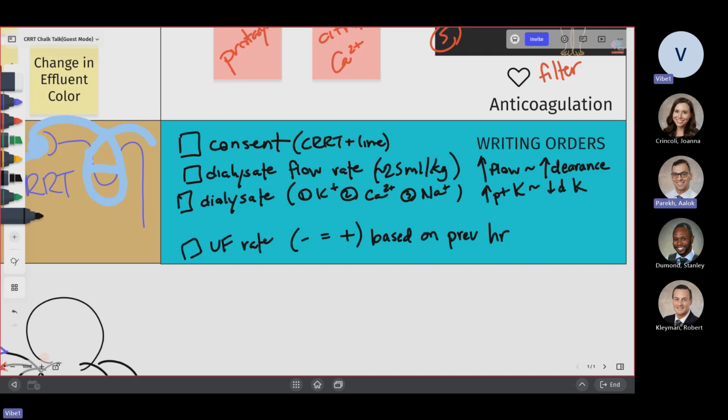That's why we can't give it post filter, like if it's just a unit of blood. You can give it. It's not a big deal, but I have to see how quickly you can run it up, because you have to have an attachment to it, because you can do it with the dialysis. I know with the dialysis you can run the blood quick over an hour.